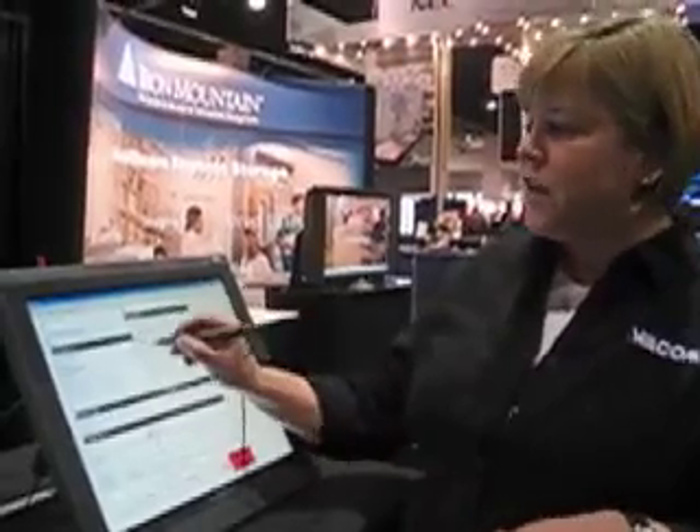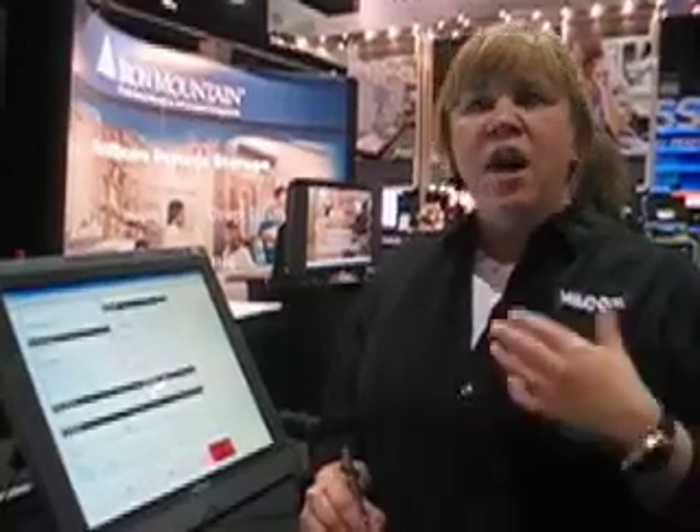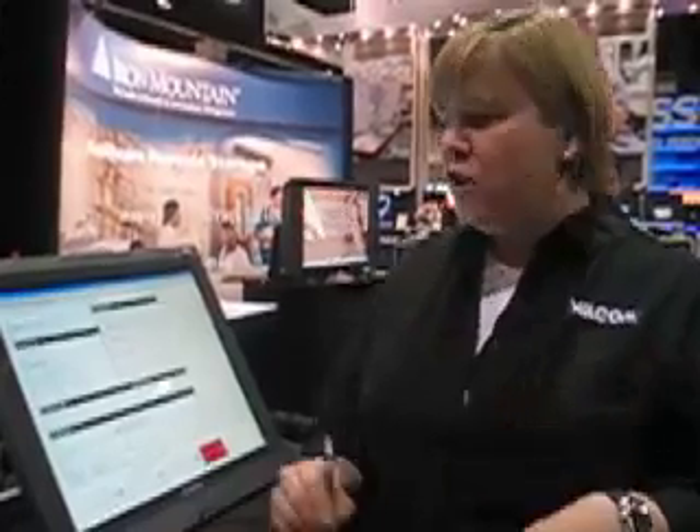So you could take the pen and work directly on the screen — the radiologist would be able to annotate over an image, do some region of interest analysis. Or for instance, if you're using a RIS system and you had to do some signature capture or enter patient information, you could do all that directly pen on screen with a Wacom pen display.